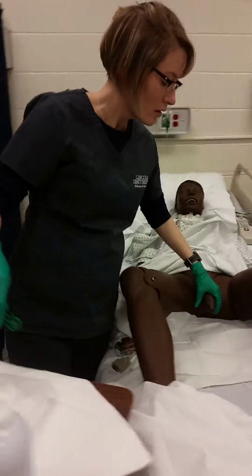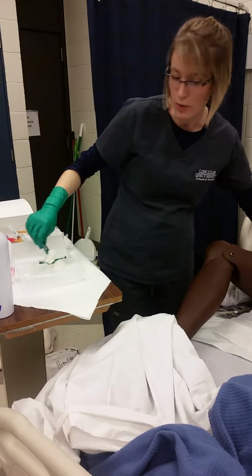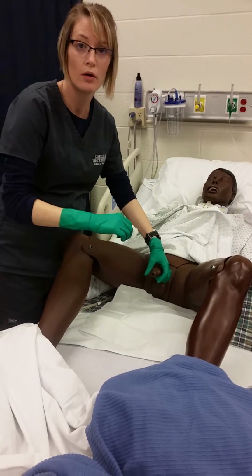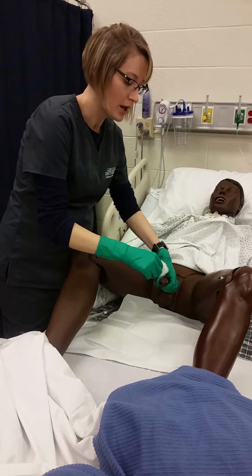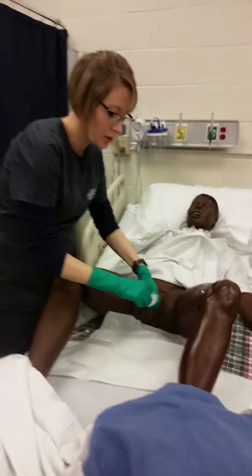So I'm going to grab the patient's penis and lift upward, taking a cotton swab, and I will clean. If they had foreskin, I'd want to pull that back and clean around the meatus. This gentleman is circumcised, so I'm just going to clean the urinary meatus and then the outside of the penis. So I would clean around it over the urinary meatus. I would throw that away and get a new one.